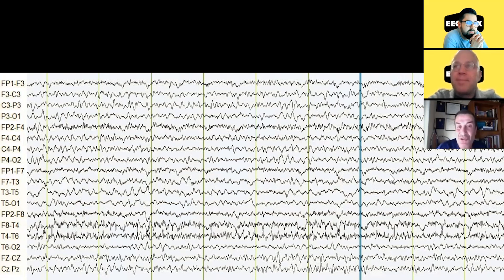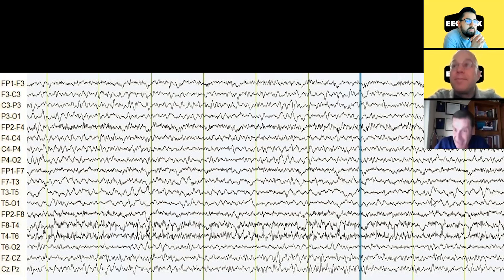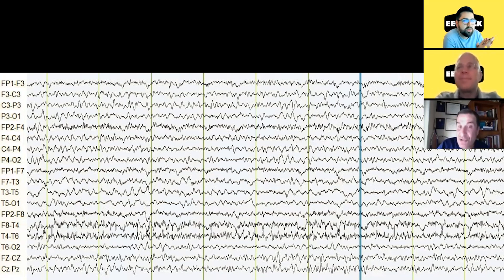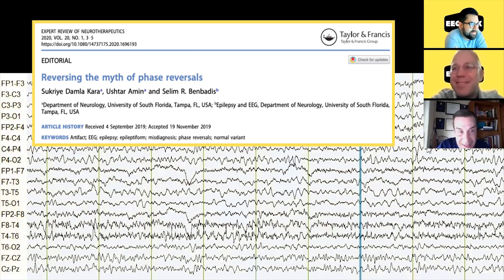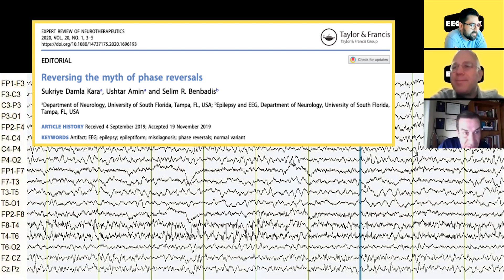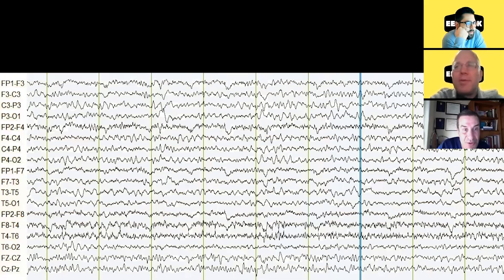A lot of these patients — the EEG diagnosis is predicated on things like this. You look at the report and it explicitly says there is a phase reversal at T5, implying that means epilepsy. That's why we have to reverse the myth. Here's a big one — that's a P4. That wave has maximum negativity at P4. It's probably part of the normal background algorithm.